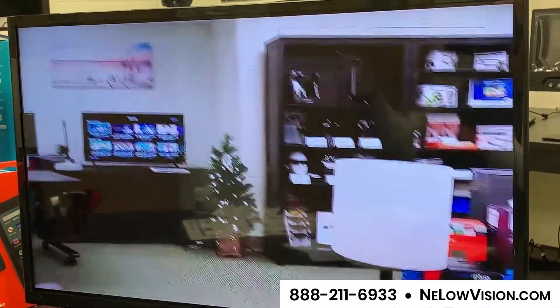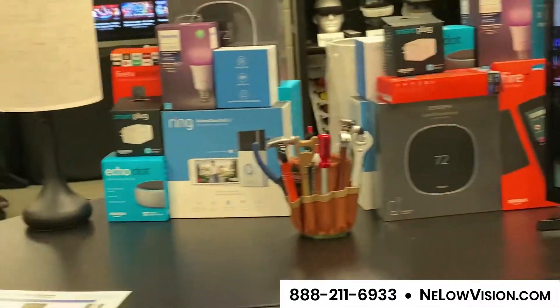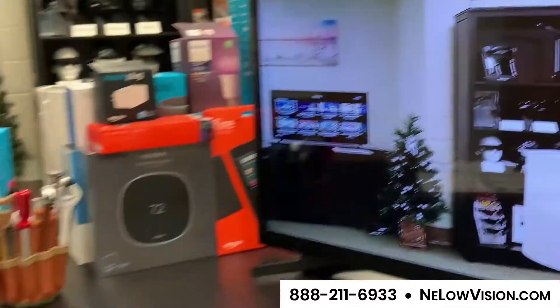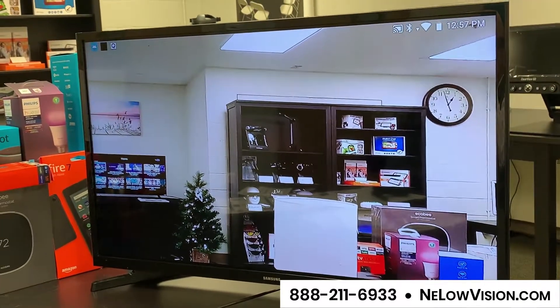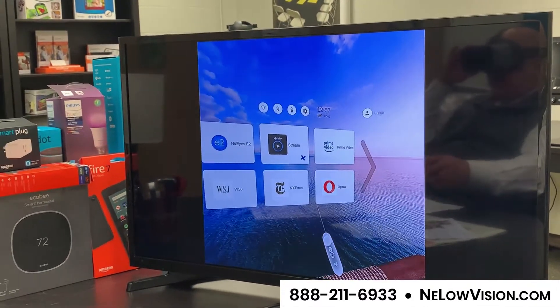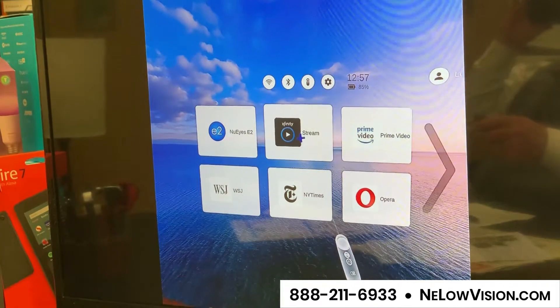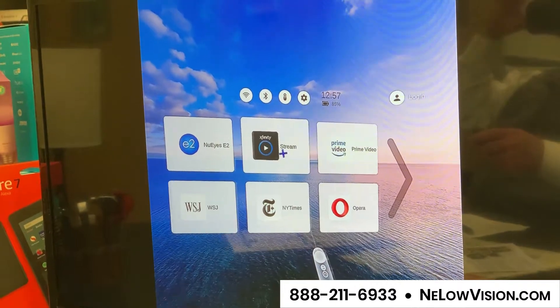What I showed you in the beginning was watching TV, but it also comes with a little remote control. I'm going to go into another menu — you can deactivate this menu for those who don't need it. For those who want to stream TV right to the device, I call this the fun mode. On screen you should see a number of tiles: here's the NuEyes tile to go back, this next one is Xfinity — all you need is an account with Xfinity and you can stream their programming right to this device.